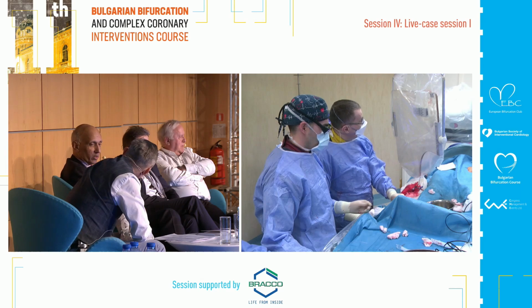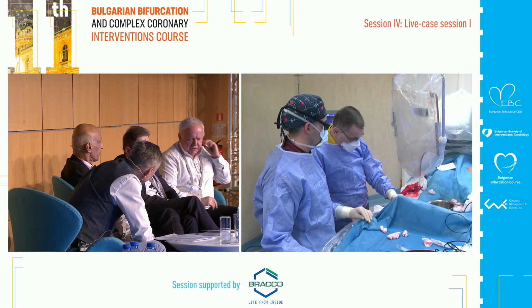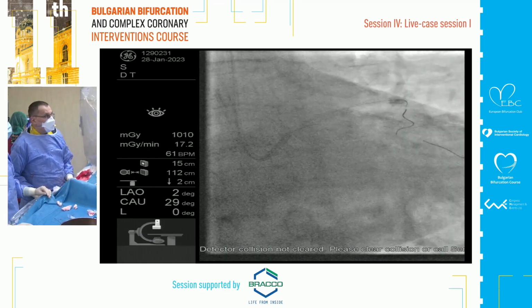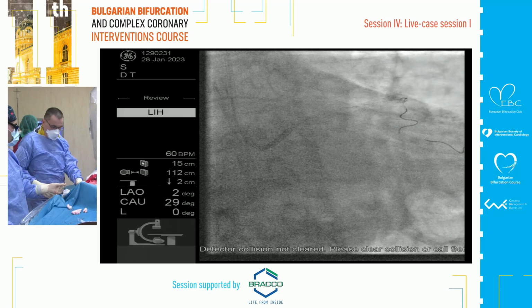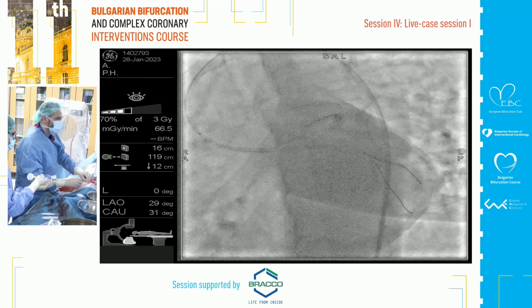Oh, you mean trying to force it through? Yes. Dobrin, do you think you are close to the end of your procedure? I will do post dilation of the stent. Okay, so I will move to the other rooms. I will go back for the result, and then we will do our final IVUS.